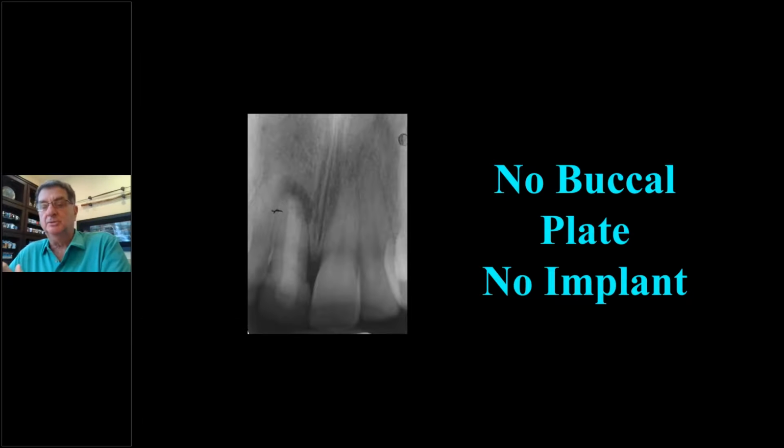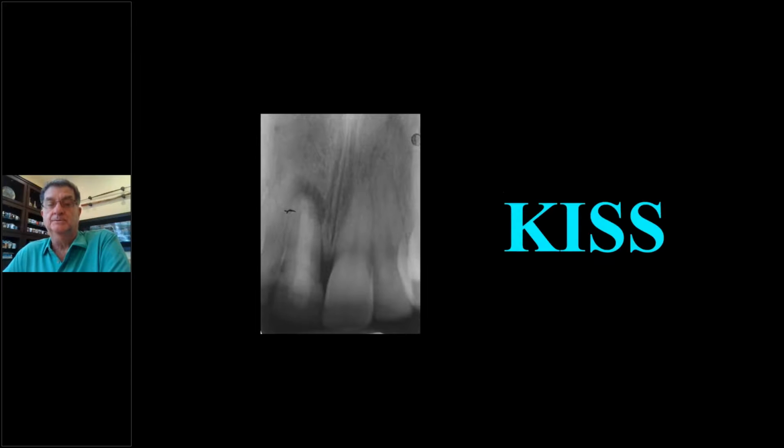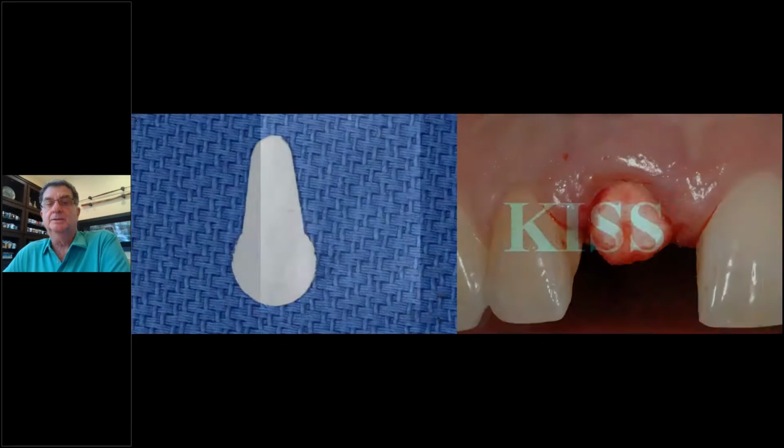Now, if you don't see it, you can play all kinds of games, but still understand that it's a crapshoot. You're just throwing the dice. You have no idea exactly where the height of the tissue will be. And so I'd rather build it up, hold it open, build it up, and then come back and place the implant and add more if I need it in a few months. Keep it simple, silly. That's what I do. And that's how I came up with this.